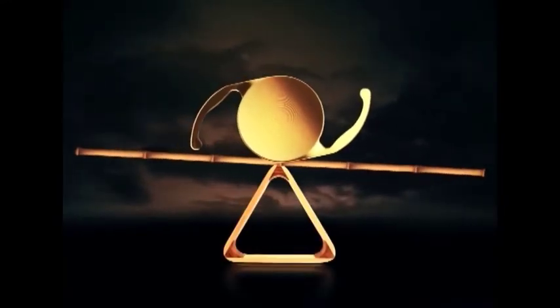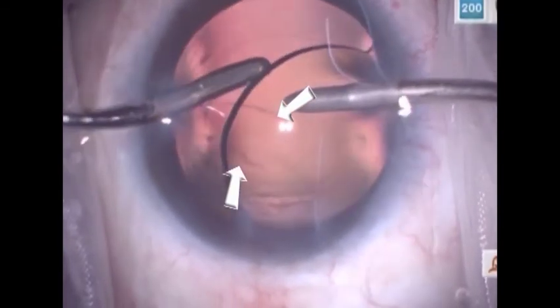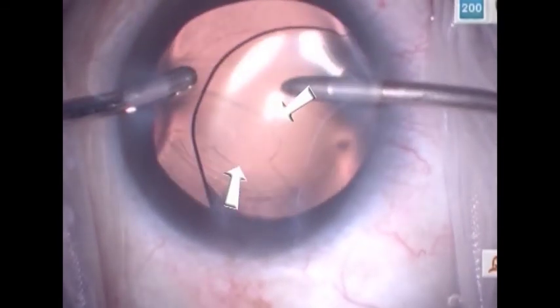Not convinced yet? Here, a multifocal IOL is implanted in the bag and viscoelastic is being removed. Oh, what's this? There's a huge tear in the posterior capsule. Presence of vitreous in the anterior chamber meant that we had to perform an anterior vitrectomy. Take a look. The vitreous has disappeared from the anterior chamber. Typically, this would have meant an end of the procedure. But we did not stop here and continued removing the vitreous circumferentially behind the IOL.